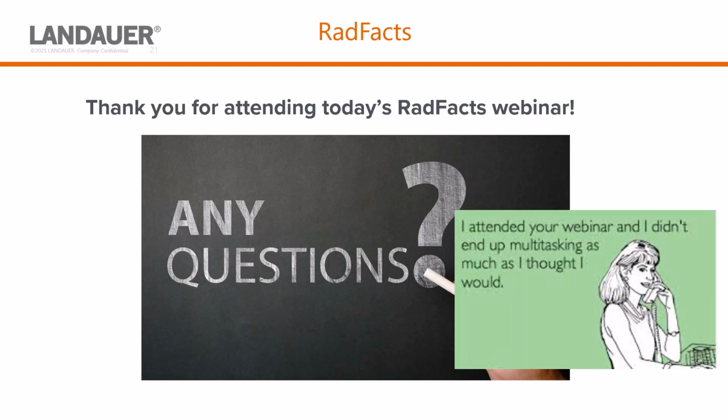All right, so let's get to our questions. First question, how do I generate my RSC meeting report from RadFacts? Oh, that's easy. You call me. No, just kidding. So what you can do is, if you have RadFacts, when you're in there, you can take screenshots, put them into a PowerPoint, and then you can launch the presentation and go through. There's a lot of different ways you can screenshot it and apply those metrics and notes on the slides themselves.